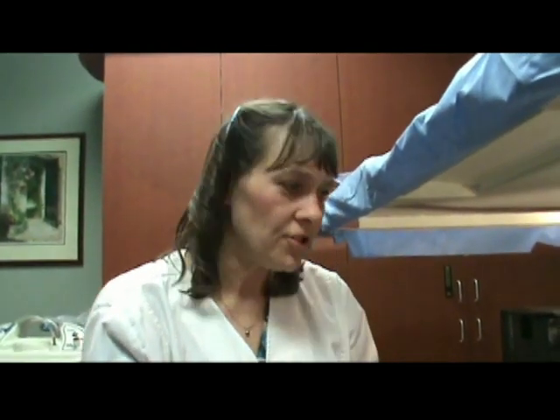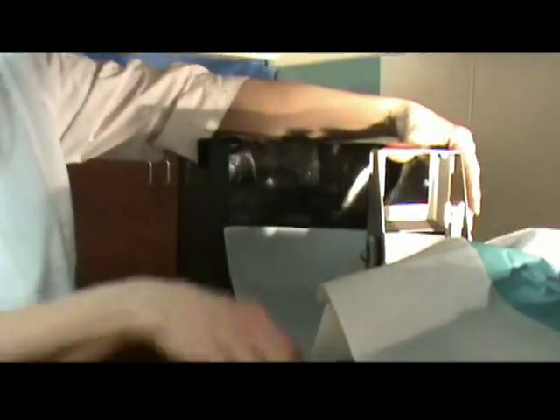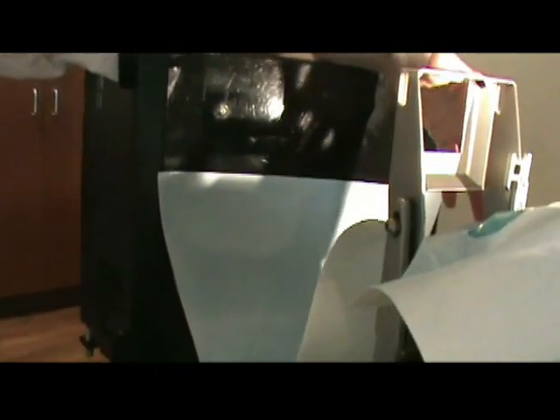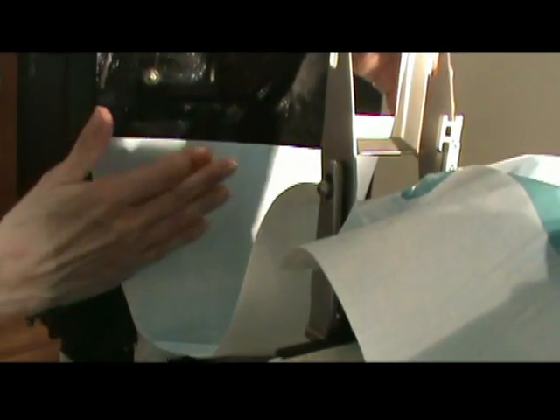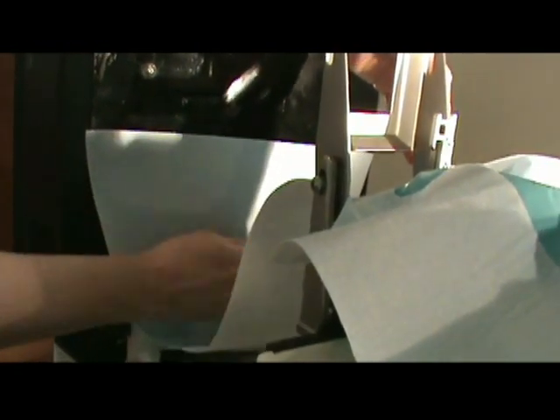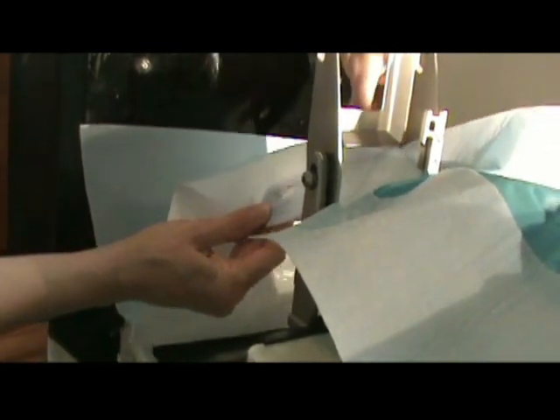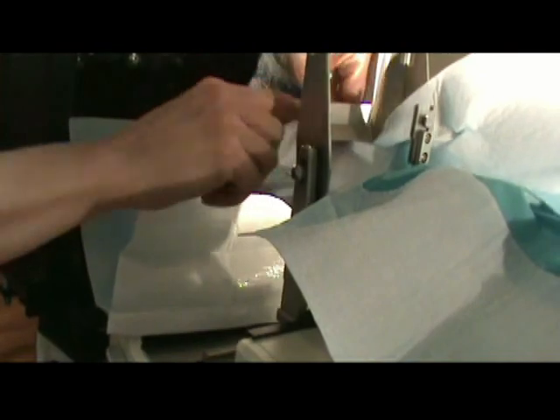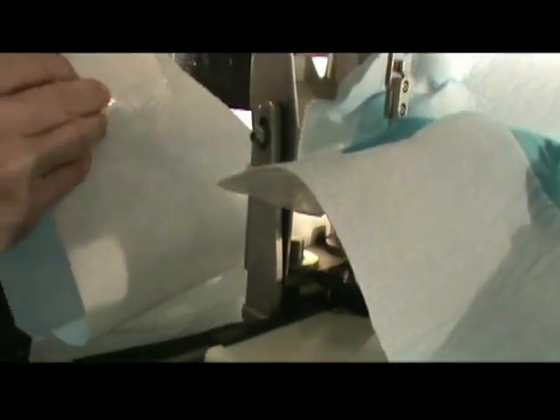Another feature of this particular drape: sometimes breasts are very large and you need a little more room for the drape to have the pockets in it. At that point you can make this into a two-piece drape by tearing the perforations right here, and on the back you'll notice an adhesive tab.